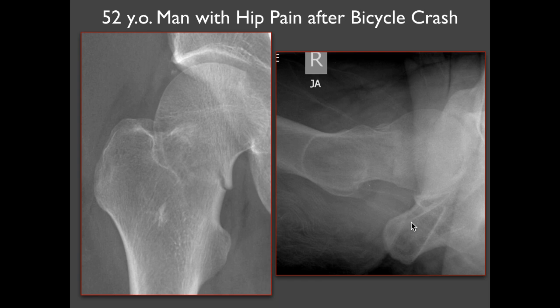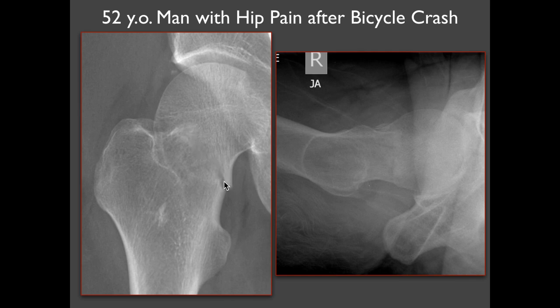Here's a 52-year-old man who has pain after crashing his bicycle. You can see the femoral head and femoral neck. There's a lucency along the medial femoral neck — that is a fracture. More laterally there's sclerosis, which is also part of the fracture where the bone is impacted and overlapping, creating increased density. On the true lateral view you can see the femoral head, anterior and posterior parts of the femoral neck, and the fracture cutting right across.